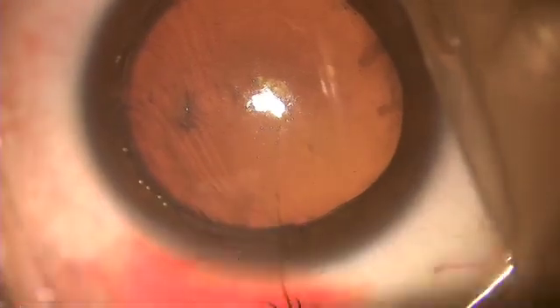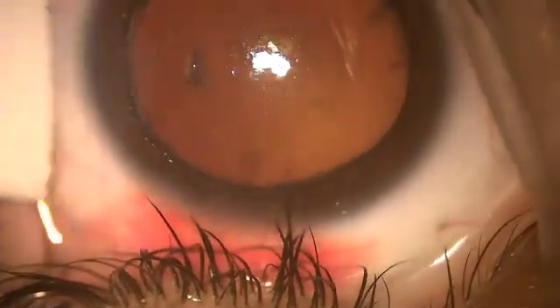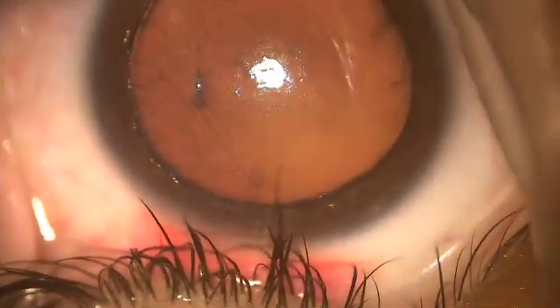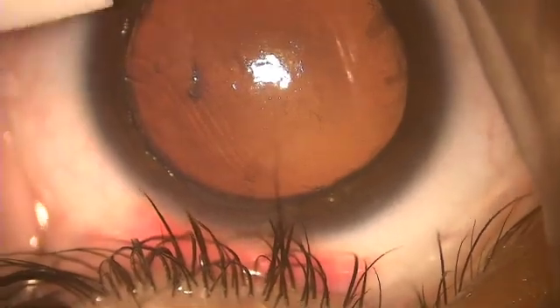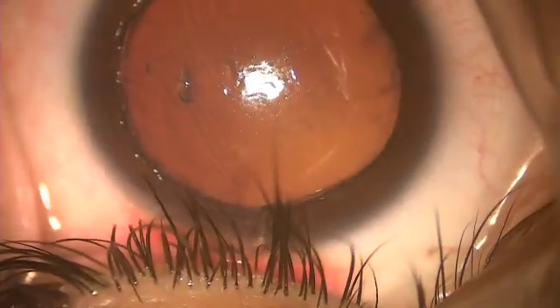This is done. Now what we are doing is trying to evert the edges to prevent any epithelial ingrowth, and again remove the excess fluid which is there to prevent any further lift. I will wait now for at least 2 minutes, and then you will want to put in a contact lens.